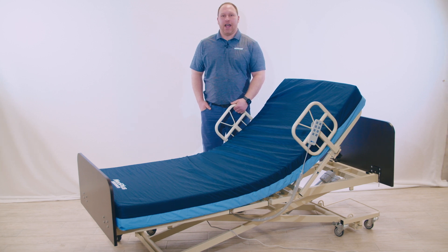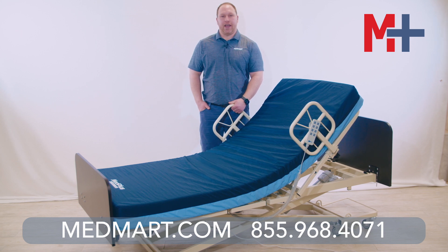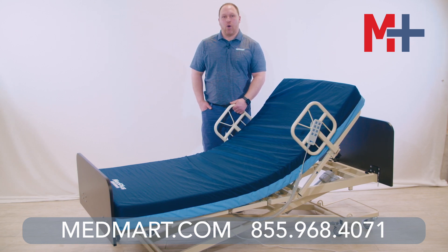At MedMart, we created the MedPlus high quality care line for comfort and safety and for the good values of our patients and caregivers. You shouldn't sacrifice quality when purchasing a home care bed. The new line of home care beds by MedPlus are just that — you can purchase a bed, a whole system, and a great mattress without breaking the bank.